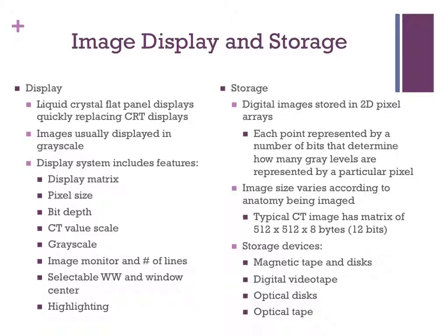Storage devices for CT include magnetic tape and discs, digital videotape, optical discs, and optical tape. The capability of the optical disc is much higher than that of magnetic tapes.